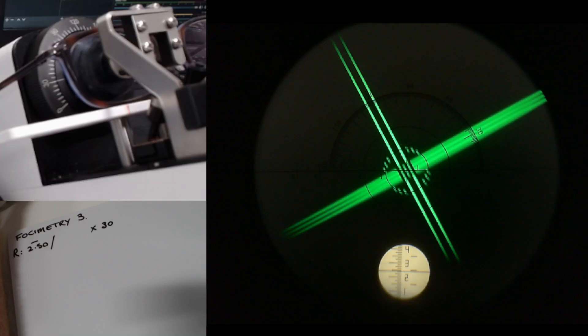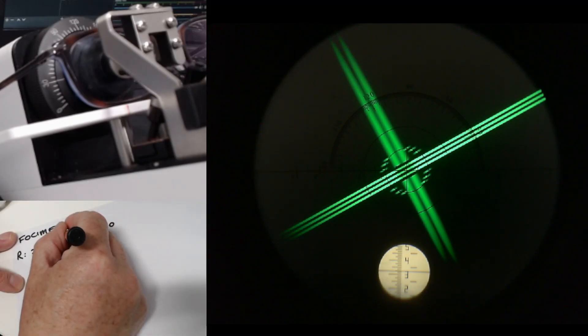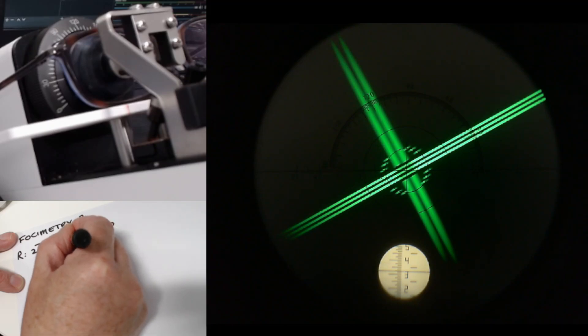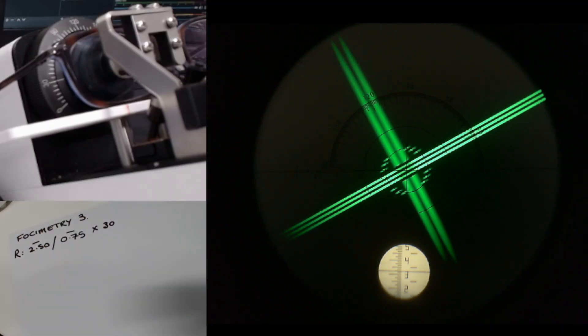I'm going to keep turning the power towards the minus end of the scale. You can see on the image that I'm just moving the power up and down slightly to make sure we get it nice and clear. And that is reading minus 3.25. So to get from minus 2.50 to minus 3.25, the difference between those two numbers is minus 0.75. So we've got a right eye prescription just there.